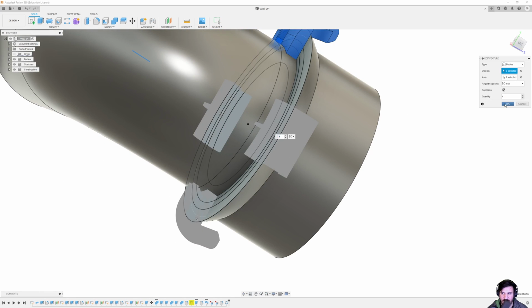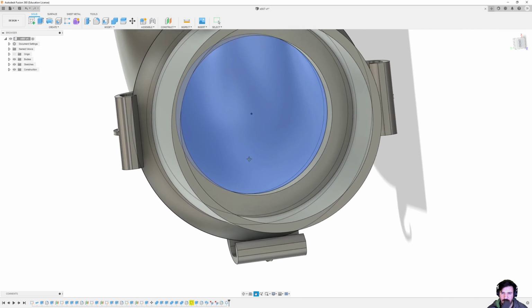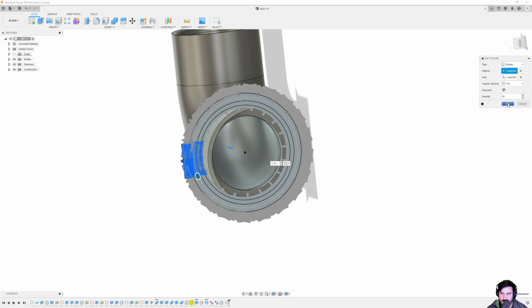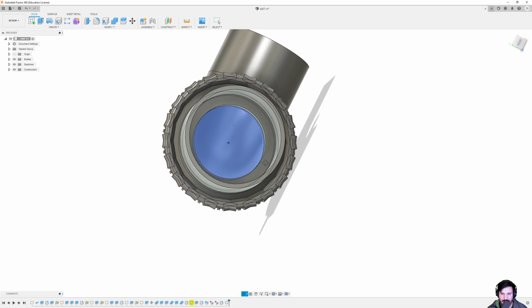So if for some reason they wanted 4 of those, I could just easily add more clips. If they wanted 20 of them, it wouldn't really print very well, but I could put in 20 of them and it would look like this and it wouldn't attach to anything because it wouldn't flex like that.